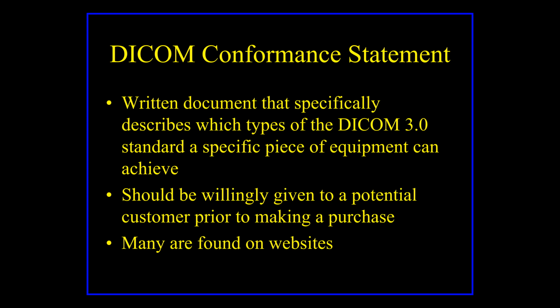Okay. So you want to make sure that whatever system you buy, that it has PACS compatibility, that it stores the images and you can catalog them and search. And also it has DICOM conformance to where you can send those images to a radiologist or to a colleague or around the world or to your home and look at them on your phone. Okay.